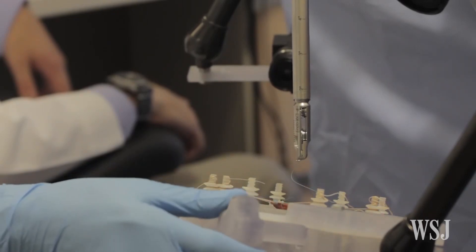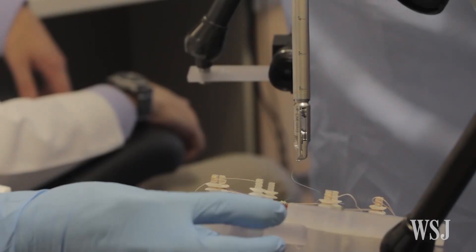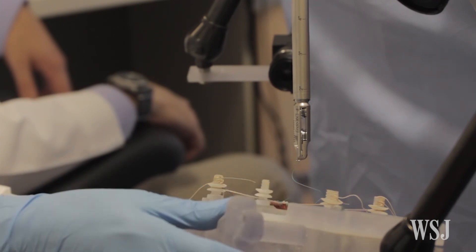The researchers say autonomous robots could potentially reduce the complications in those surgeries. Probably the most surprising part was that when you actually compare that to current standards of practice, the machine does it better.